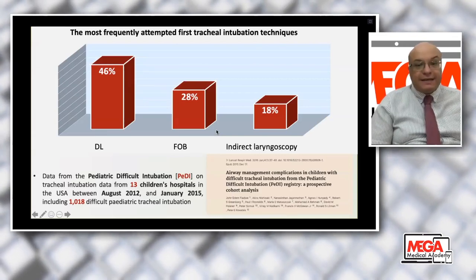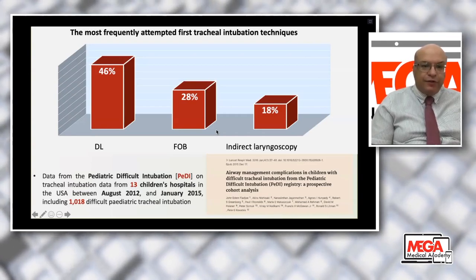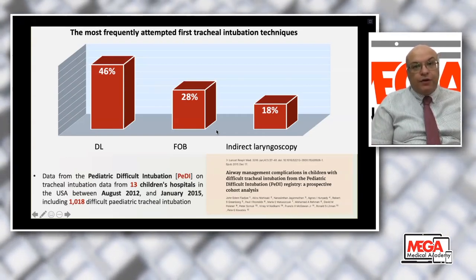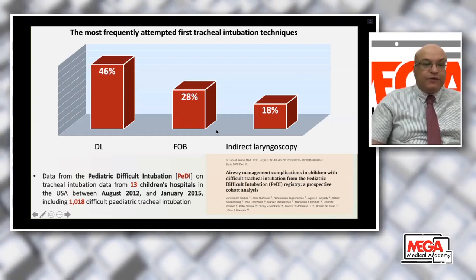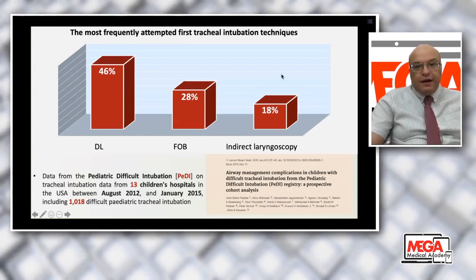Why I'm asking this? Because there is a large database from pediatric difficult intubation, including 13 children's hospitals in the United States between August 2012 and January 2015, including more than 1,000 pediatric tracheal intubations. You can see here.